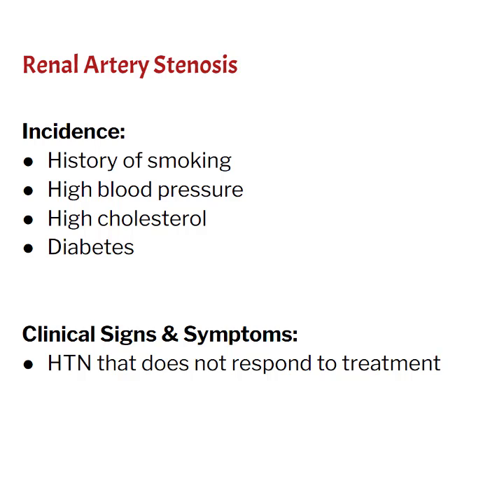Now, the most common reason that a person has a renal artery stenosis exam ordered is because they have blood pressure that does not respond to treatment. There's tons of medications out there that can help the body regulate blood pressure, but the kidneys also play an extremely important role in it. And when that medication doesn't work quite the right way, we start to think that it has something more to do with the kidneys because that medication isn't working appropriately.